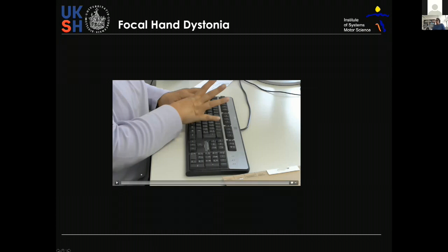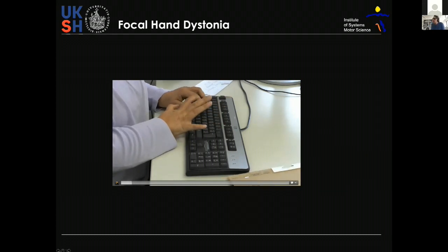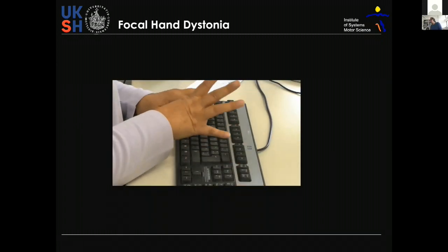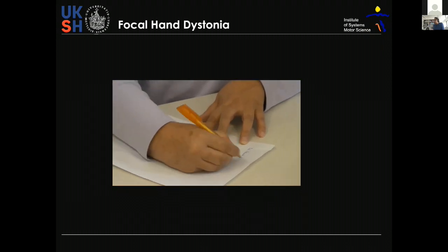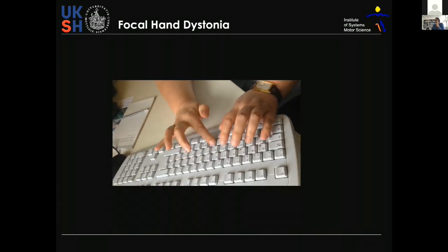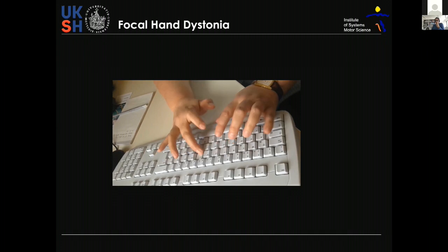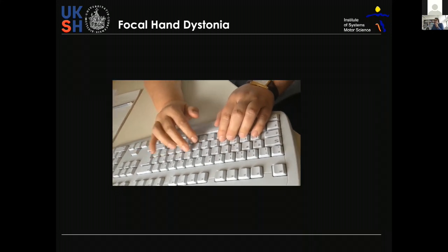Our main topic is cervical dystonia, but just a small clinical example of a patient with a focal hand dystonia. Especially in these kinds of movements, a treatment, especially of extensors, is really difficult, and the therapeutic window is very narrow. And this patient was injected into the extensor of the index and the middle finger, and this worked quite well. But you have to be very, very focal, and you can do this by EMG, of course, but it's quite easier to do this with ultrasound because you see what you're doing.